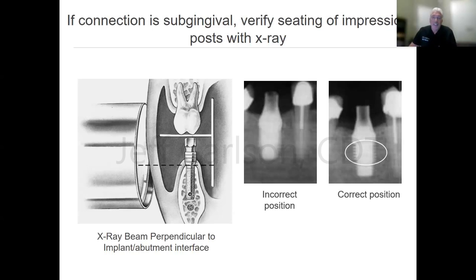But here's a tip for you. If you look at your radiograph, whether you're using a pano or a periapical, bitewing, etc., I like to say, do a periapical, but think bitewing. When you can do a bitewing in certain areas, that's great to do that.